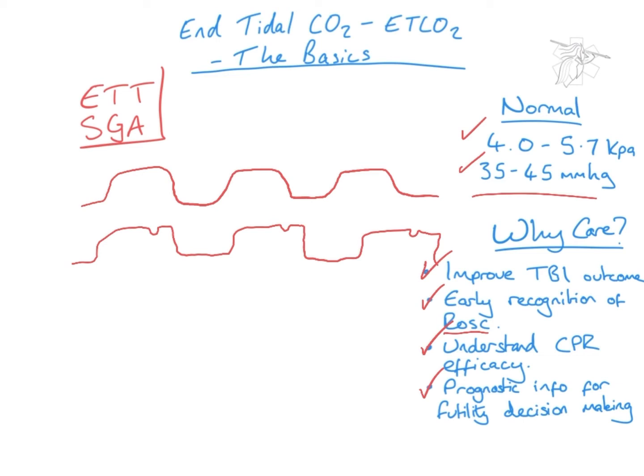A couple of things that can help. We can actually diagnose some problems from end-tidal CO2 capnography. So if we were to get something that looks a little bit like this immediately following intubation of a patient, that could actually tell us that we've inadvertently intubated the patient's esophagus. So that would be an extubation followed by your failed intubation drill there.